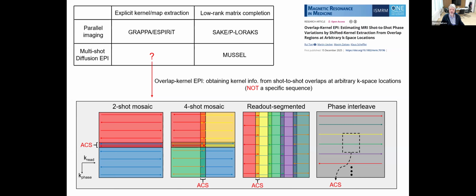Right. The question was that in your formulation, the overlap is not everything with everything. You can have pairwise equations for your two segments, but from one overlap area you don't get equations linking all of your virtual coils, as you would want for GRAPPA, right?